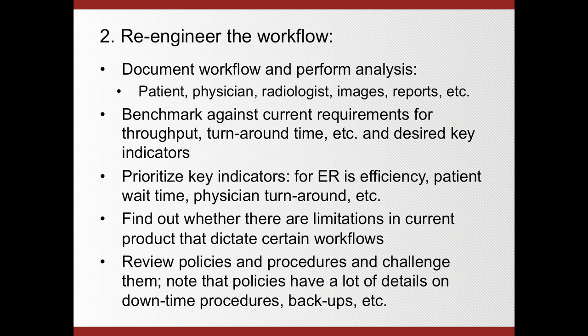Some institutions want to optimize certain areas for certain people. For example, in the ER, it's pretty common to try to optimize it for the patient, if your strategic objective is to reduce the turnaround time in the ER. Other ERs might not necessarily be focused on reducing the turnaround time for the patient, but maybe for radiologists and physicians, if they are bound by limitations in the number of physicians and radiologists available. So depending on the requirements, you can then take the workflow and re-engineer it.